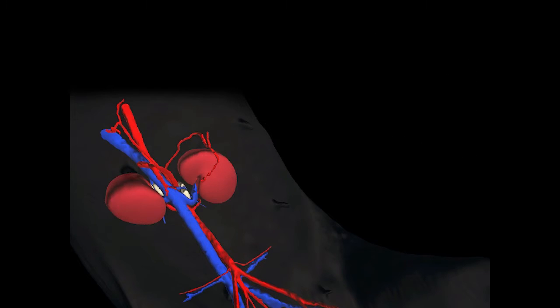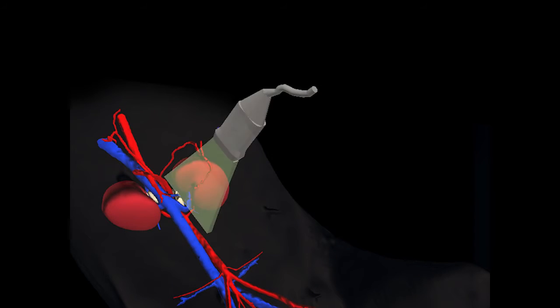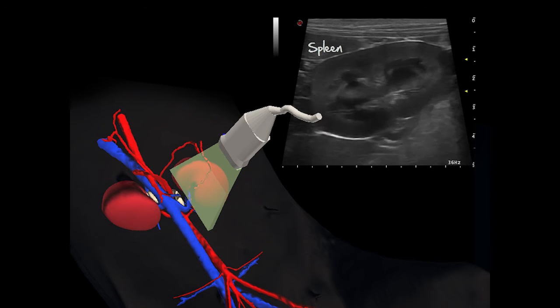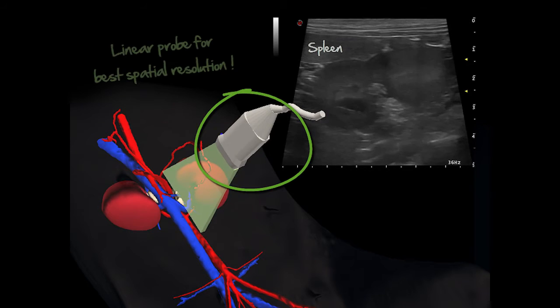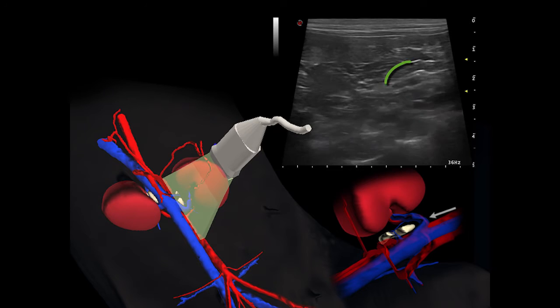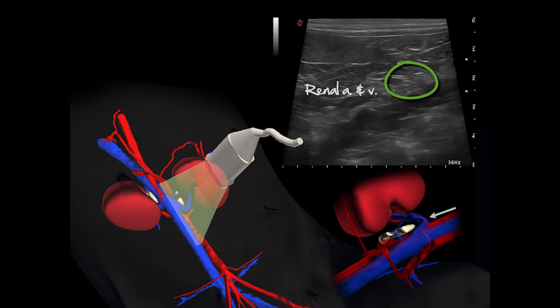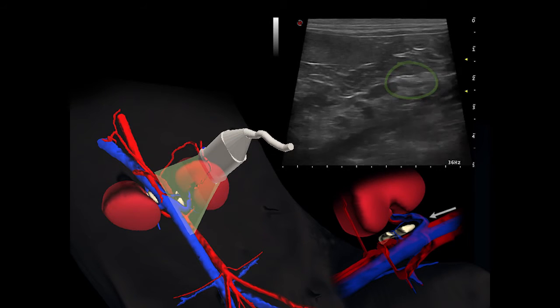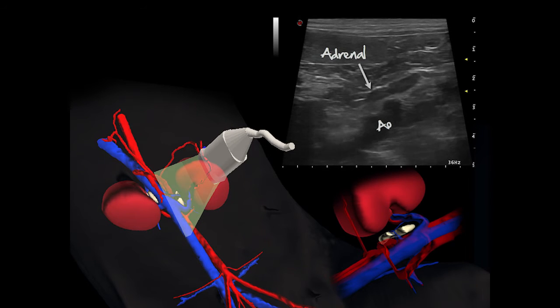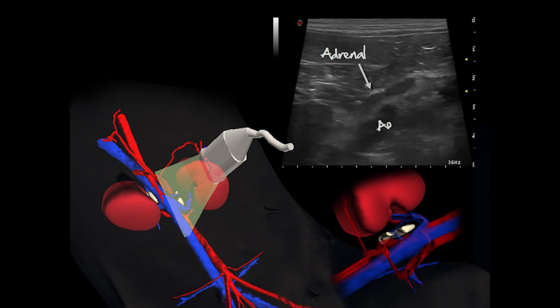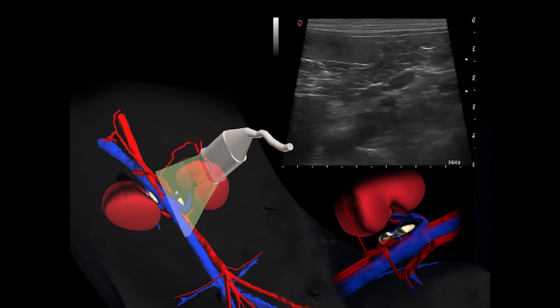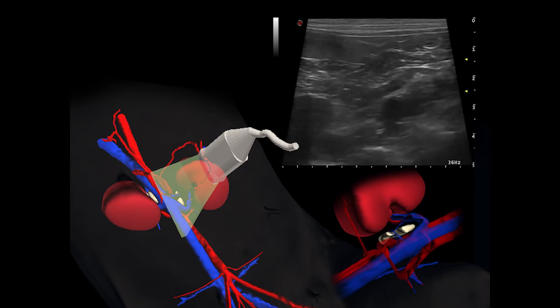When the surface of the abdomen is flat enough and the patient tolerates a gentle pressure of the probe so that the adrenal becomes only a few centimeters deep, a linear probe is the best choice to obtain images with the best spatial resolution. From a longitudinal plane of the kidney, the renal artery and vein are scanned as you move medially toward the aorta. Observe the characteristic shape of the adrenal — it looks like a slightly flattened peanut with a weak echogenicity, slightly above the one of vessels. When in doubt, color Doppler can help differentiate this structure from a vascular lumen.